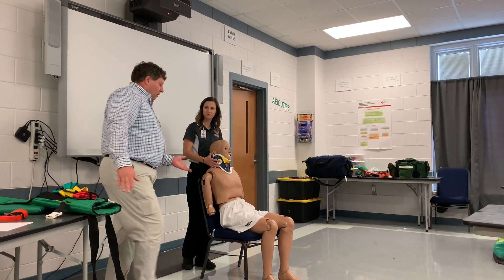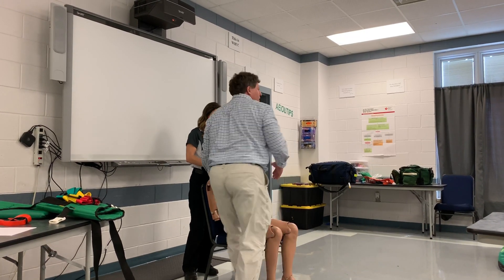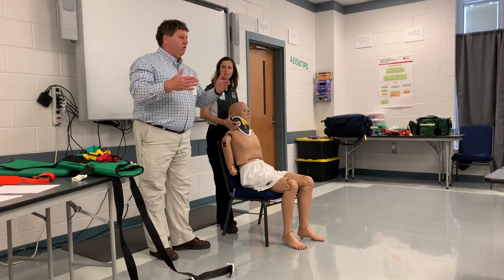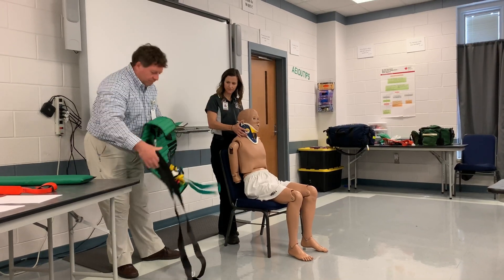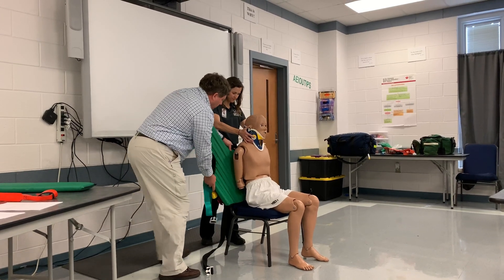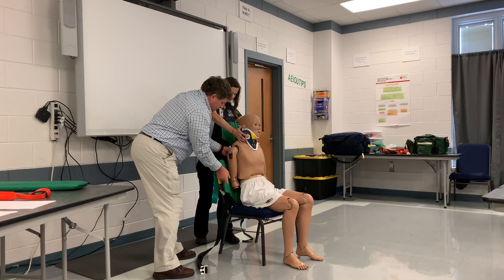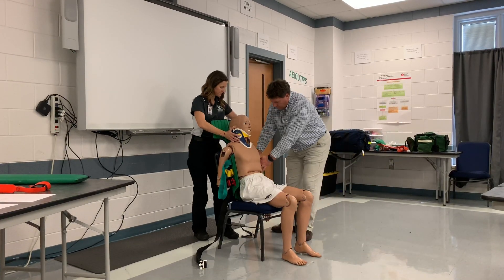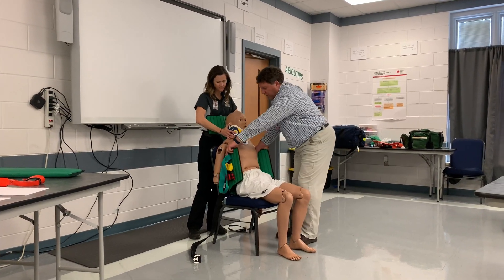If they're in a chair like this, I can come around the front and move them just a little bit off the chair. Or if they're in a car, obviously I can't stand there because that's the dashboard. They might be able to pull themselves forward a little bit, but I need a little space to slide this in. Slide it behind and get it pretty much in line with their spine, come under their arms, and I want this up tight into the armpit - so I'll slide it up just a little bit.